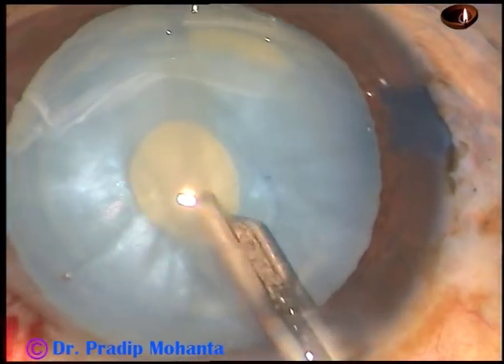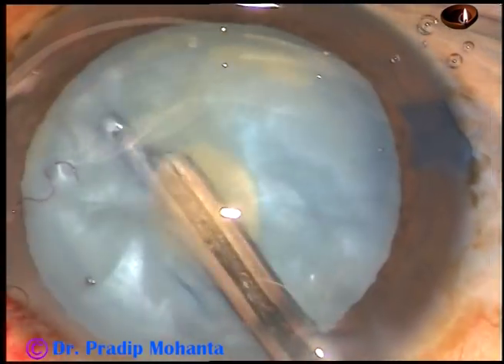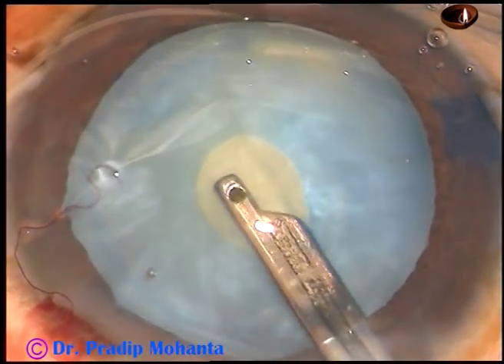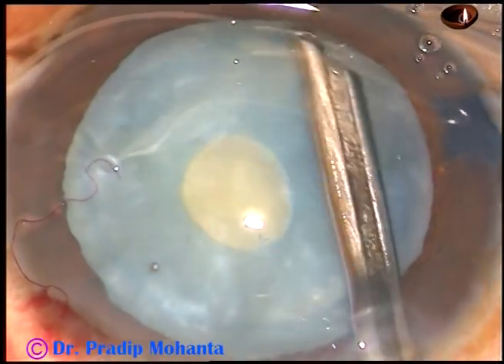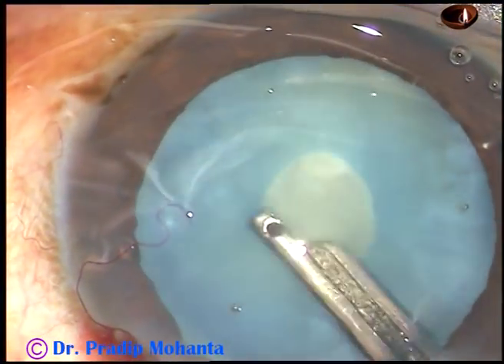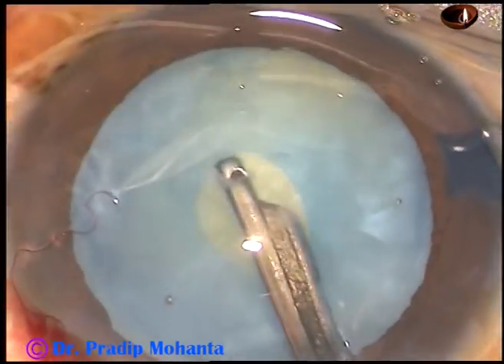In intumescent cataracts, the intralenticular pressure is very high. Once you aspirate some cortex, the intralenticular pressure reduces. But there should not be any elevation on any side — all around, the capsule should be flat after aspiration of cortical matter.